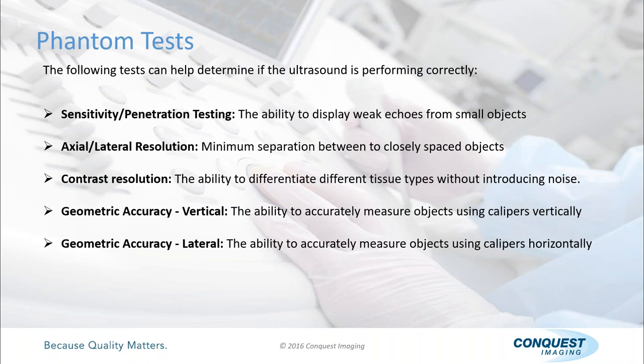Now, do they vary very much? In other words, do the calipers change? And the answer to that is no. It used to be in the old days, you'd get a little tweaker and adjust the potentiometer to make them read what you wanted to read. They got rid of all that. It's all software generated now. So in 15 years, I have never had the calipers not meet the specs of an accrediting organization.